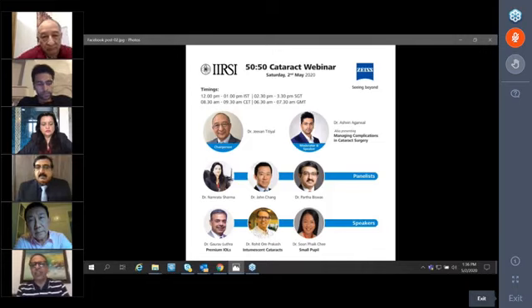Dr. Chee, these fibrotic ones usually do not extend to the posterior capsule and beyond. So I think phacoemulsification can be continued in such cases, but dissection and using bimanual forceps can help to take it out. And you can use visco also to go beneath where you create a plane; you take a visco cannula and inject. So that will further help.